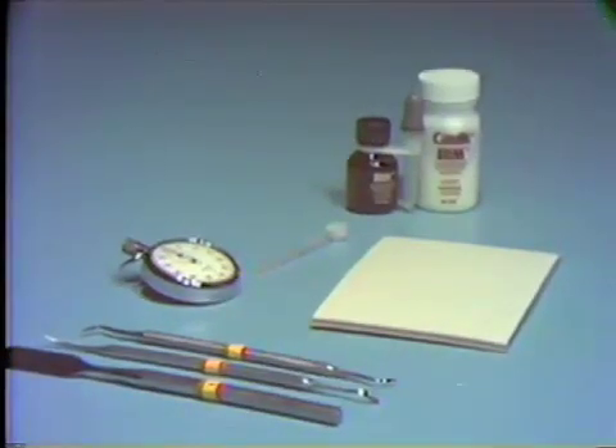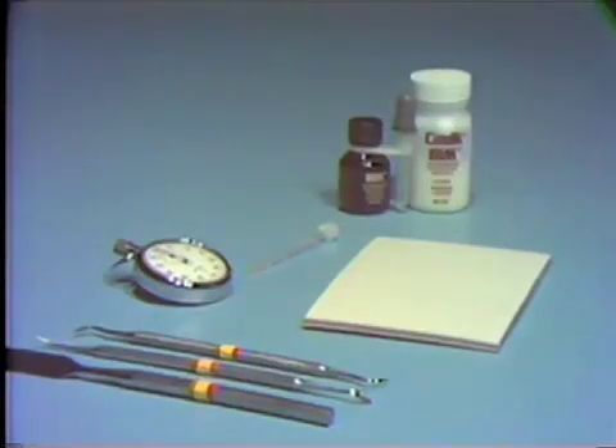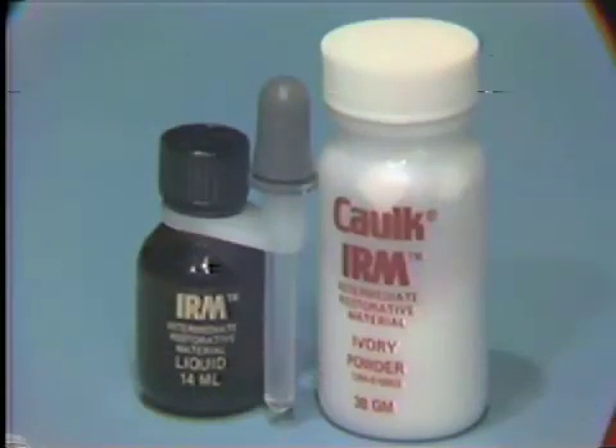We would like to demonstrate for you the mixing of a polymer-reinforced zinc oxide eugenol cement. The material that we'll be using in the laboratories and clinics is called intermediate restorative material, or IRM. The material is manufactured by the L.D. Caulk Company in Milford, Delaware.